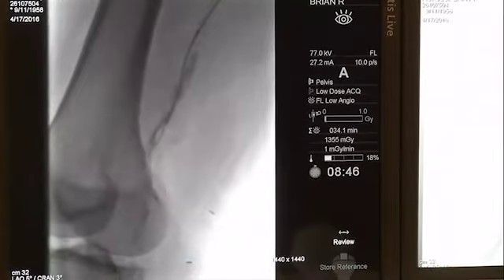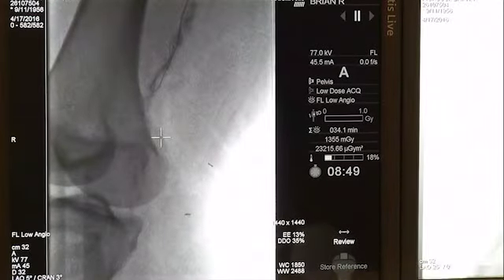Come down. So we are dealing now with another lesion. Going back to Thomas's point, if we had come from the AT, maybe we didn't have to deal with this right now in some ways. But these are the challenges we deal with. So I'm just going to force a little bit. Go down, please, push it. But if we didn't bring that sheath down, we couldn't do any of these things. So bringing the sheath down was extremely important in this situation. Come down a little bit. All right, stop right here. Let us reassess the situation. At this moment, I'm going to take some angios and see what's going on.